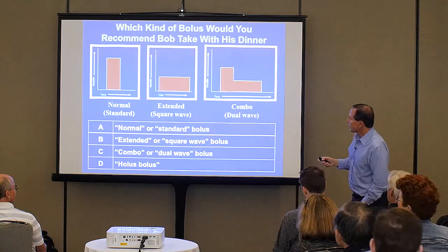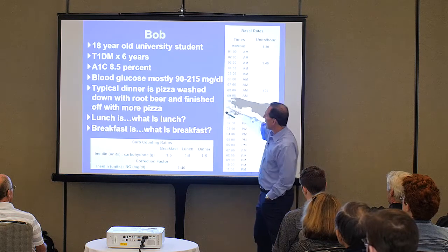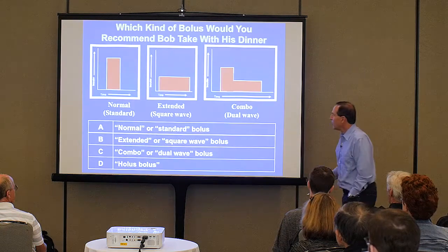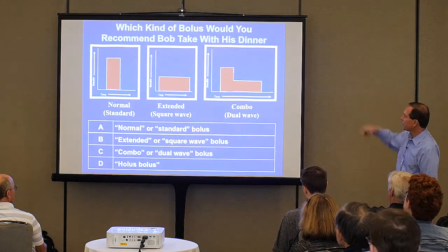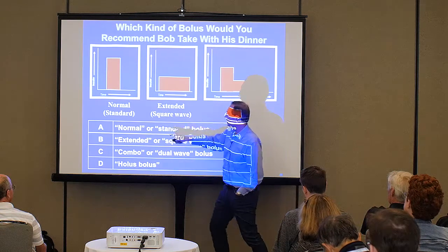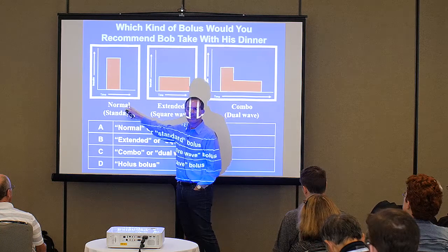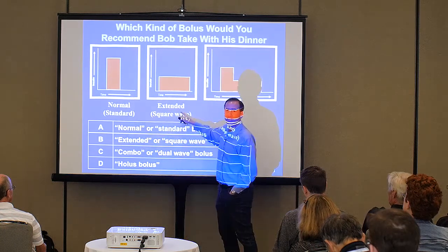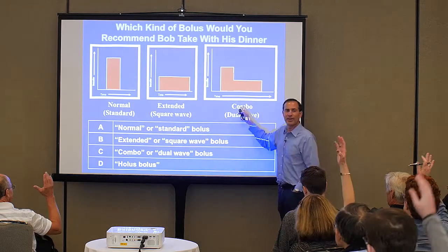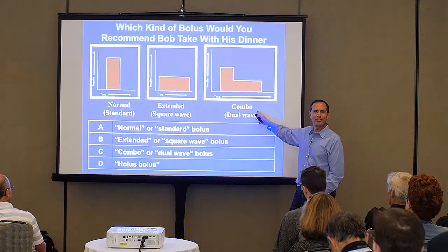So if someone is like Bob, and most teenagers are, what kind of bolus should he take with his dinner? And I'll come back and explain them more in a sec. This one, or who votes for this one? Put up your hands. Okay, who votes for this one? And who votes for this one? Wow, you guys are awesome. It's unbelievable. So why did you choose this one?